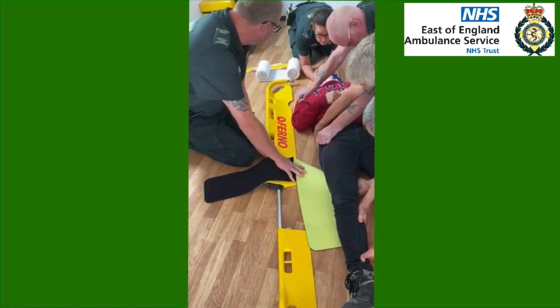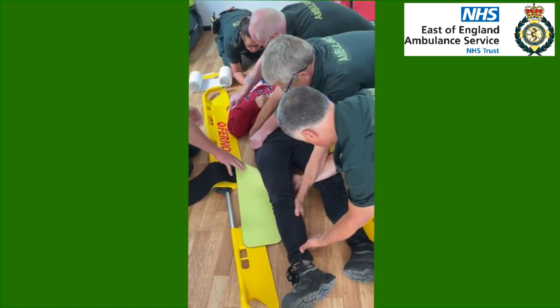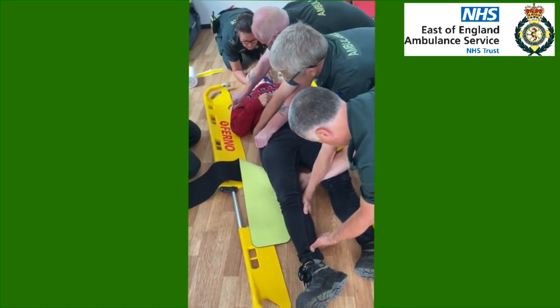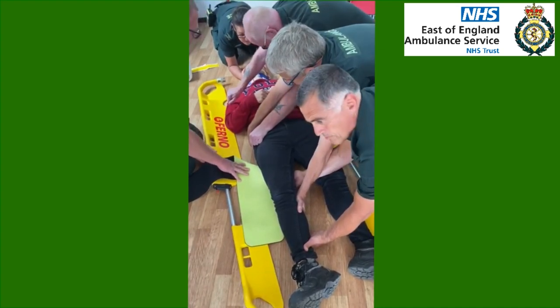The pelvic binder's in place over the greater trochanter and Sarah's in place. When you're ready Sarah, we're going to do a 15 degree roll — on ready, set, move — and I'm going to slide the scoop under. So on your command please. Ready, set, roll.